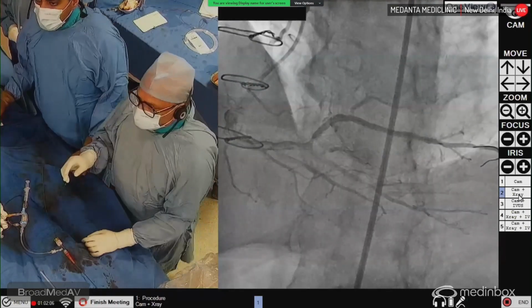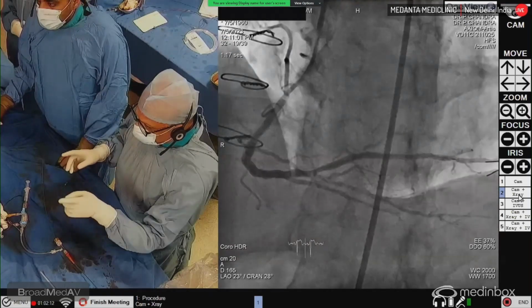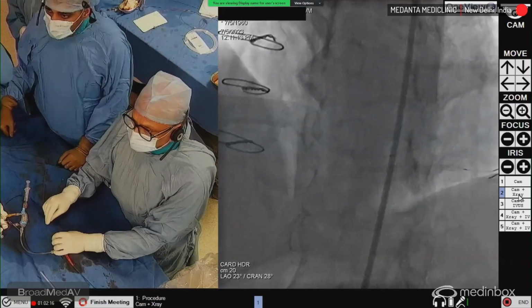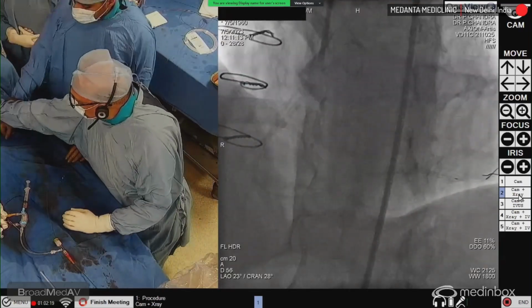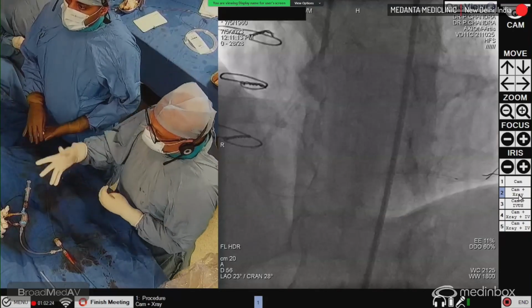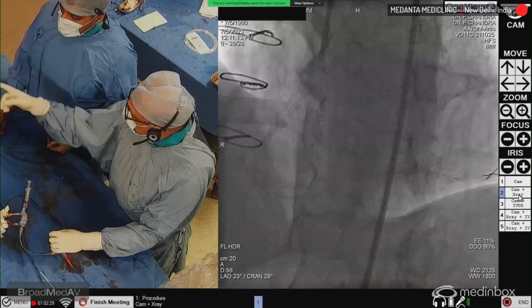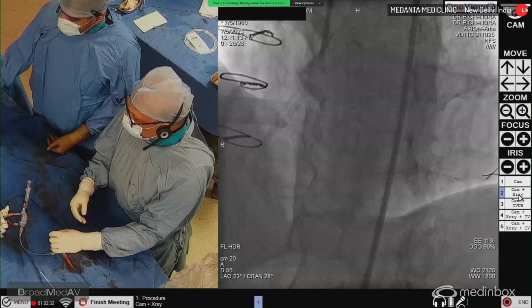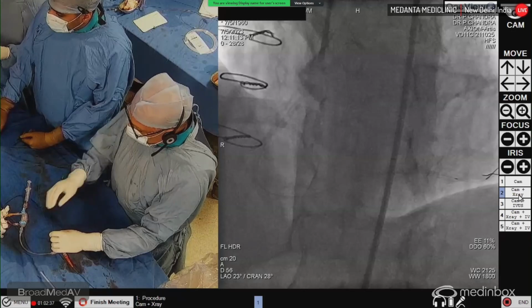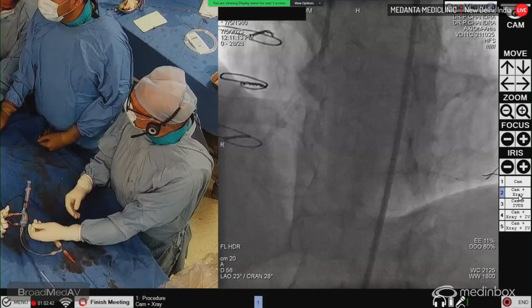Yeah, this looks very good. So we can do a post dilatation, and in the proximal part of the stent, it is at least 2.75 or 3. Extension went in. Guide extension has gone in because of that injection. Flush injection. Yeah. So can you give me a balloon, please? The proximal vessel size was how much? 3? 2.75. 2.75-ish. 2.75. Proximal.